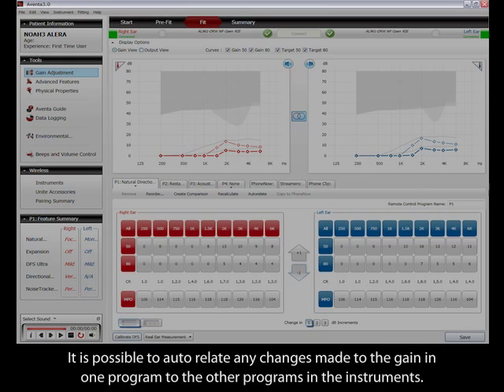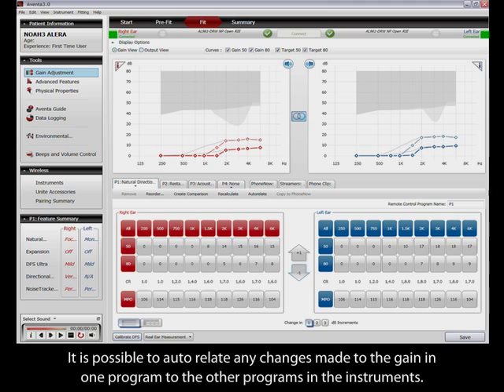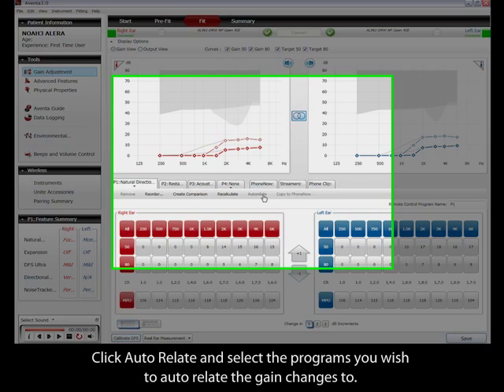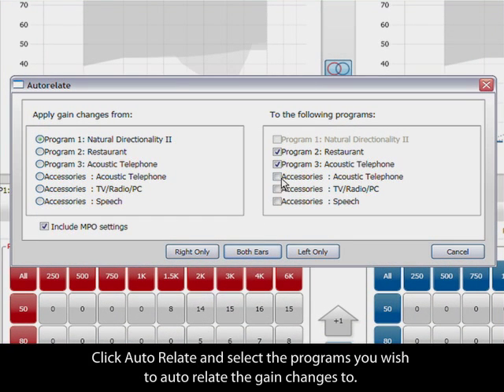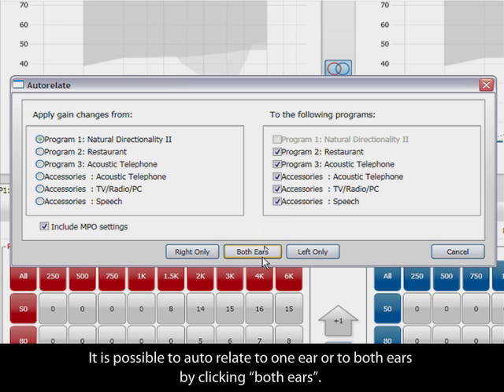It is possible to auto-relate any changes made to the gain in one program to the other programs in the instruments. Click Auto-relate and select the programs you wish to auto-relate the gain changes to. It is possible to auto-relate to one ear or to both ears by clicking both ears.